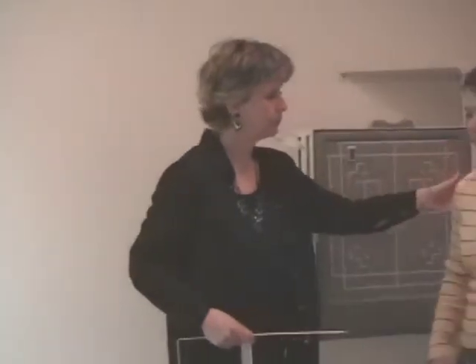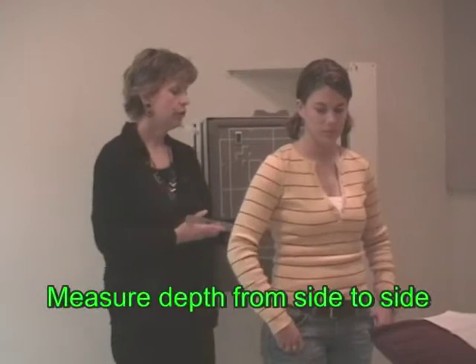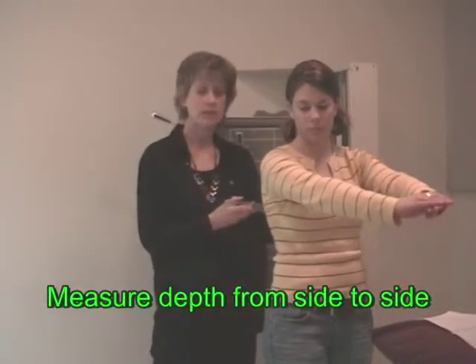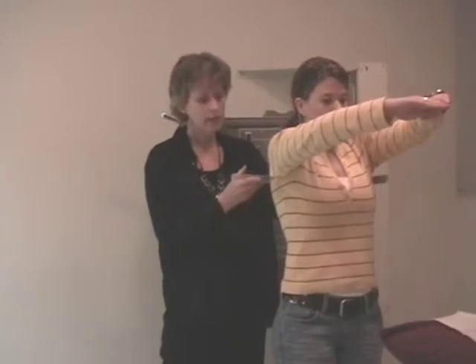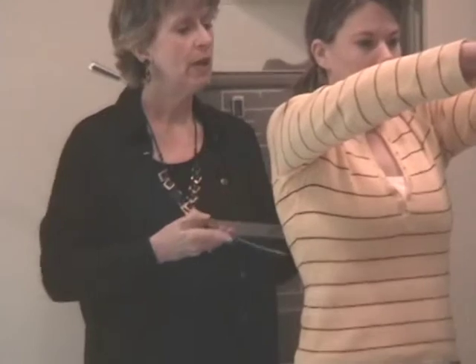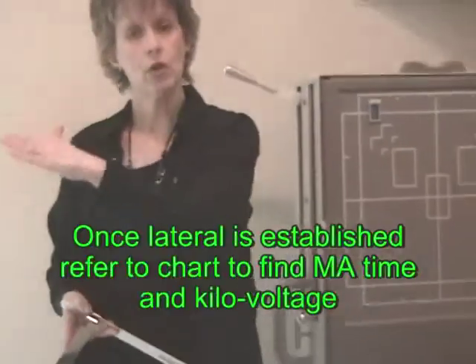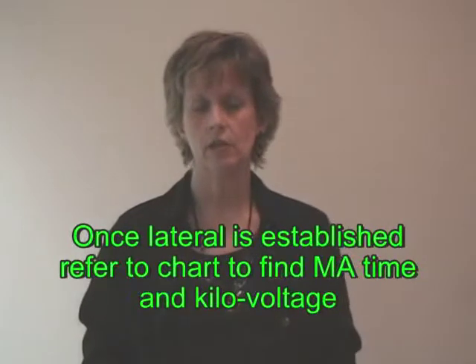When it comes to the lateral, there are two ways you can measure for a lateral or set the panel for a lateral. Again, you're going to want to measure her depth from side to side. Arms up, please. Taking a deep breath. Come right up underneath the axilla. Andrea measures 36. You may breathe and relax. I would go to the chart, look up 36, and find my MA, time, and kilovolts for that.